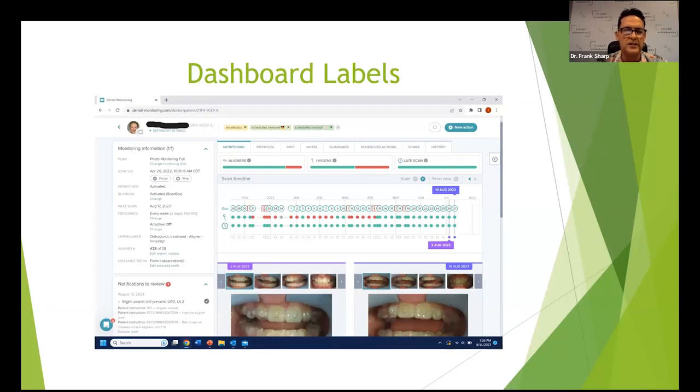This is just a patient example. She's not wearing any elastics. We have her scheduled for removal, yet we have her scheduled for a revision in our office. We always look at them in person. And if they're ready to get them off that day and get the attachments off and go to retainers, we've got time in our schedule and we do it that day for them.